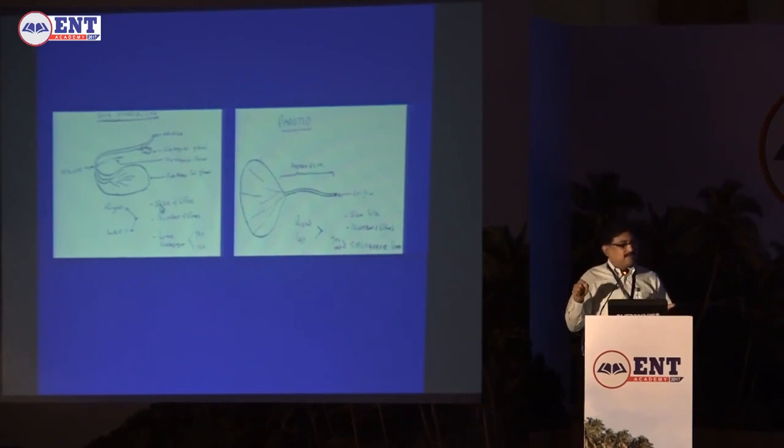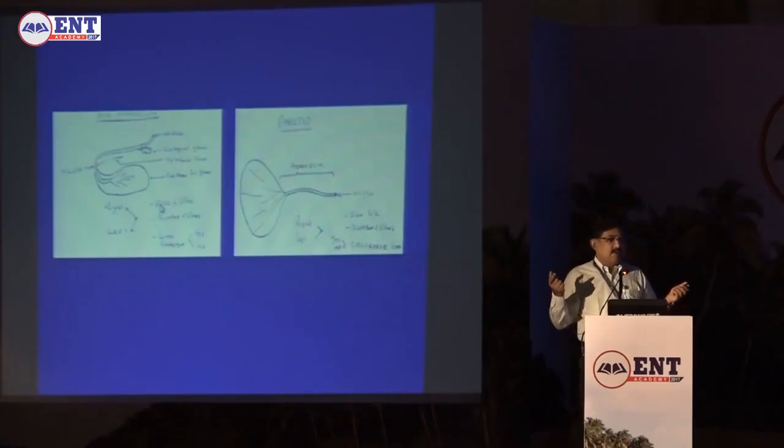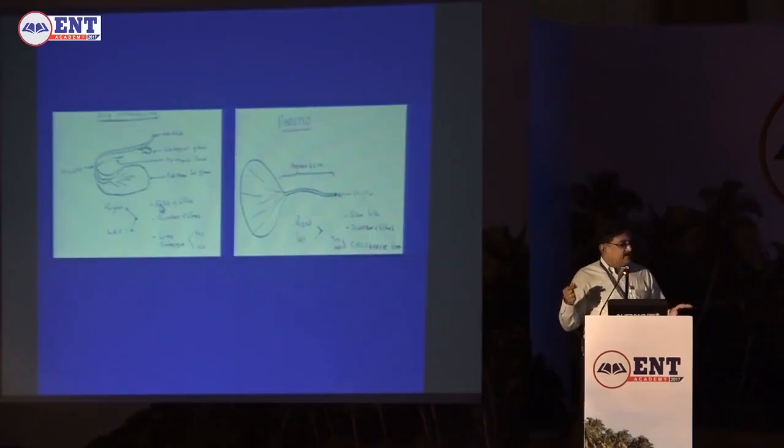You will know where it is. For example, if the stone is somewhere in this gland here, salivary endoscopy just cannot reach. So you know nothing is going to be done. Mylohyoid muscle also is marked. Above the mylohyoid muscle, one can reach with the scope. Beyond that, you can't reach. You have to use some special techniques for it.